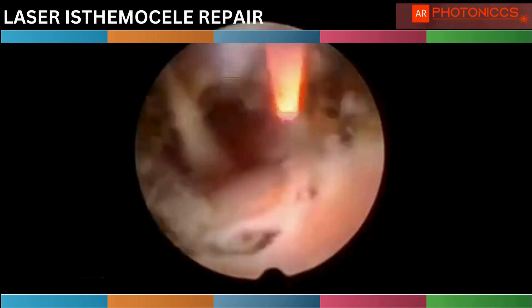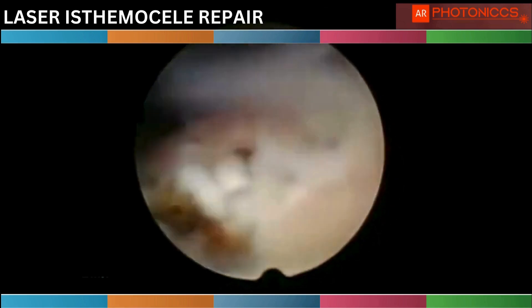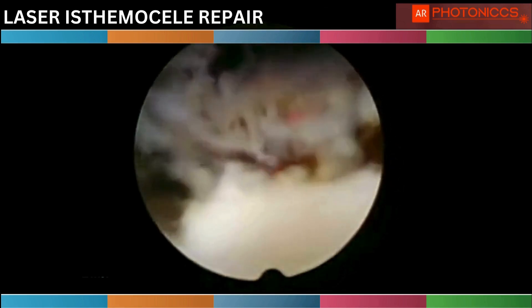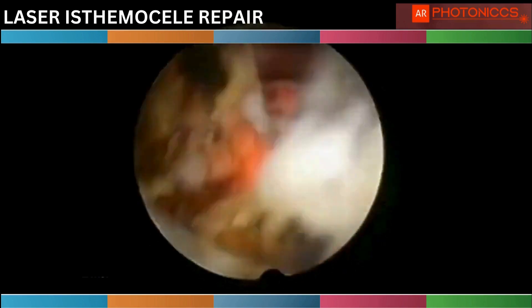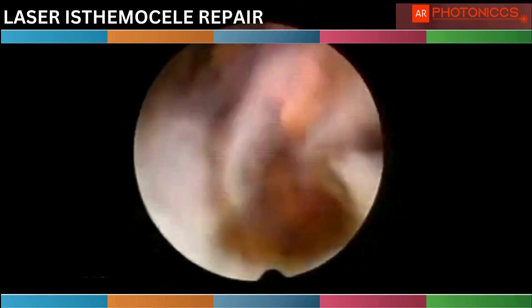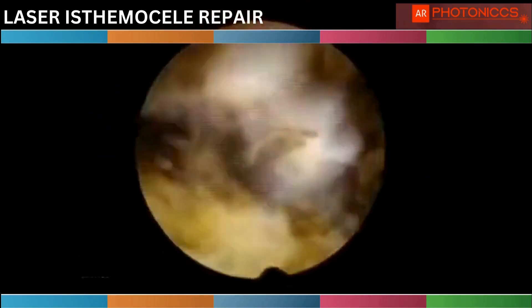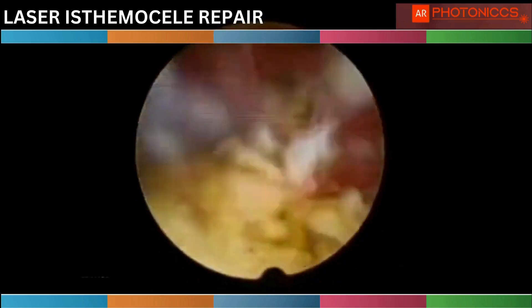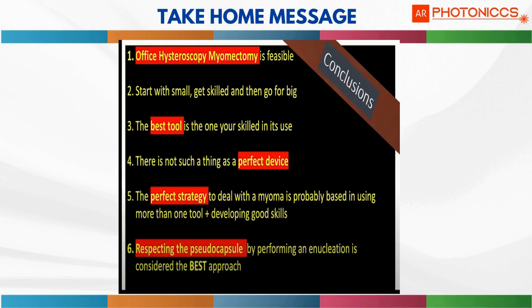The patient has a lot of benefit compared to hysterectomy — you can avoid hysterectomy. That is the beauty of the laser. You can have multiple indications and use the diode laser in the hysteroscope. Today we use laser in cosmetic gynecology, proctology, varicose veins, thyroid, and dermal treatments. It is a very compact device.